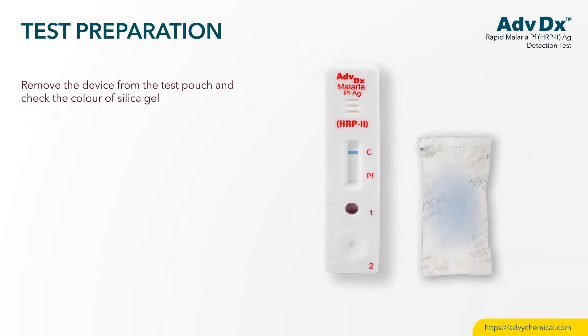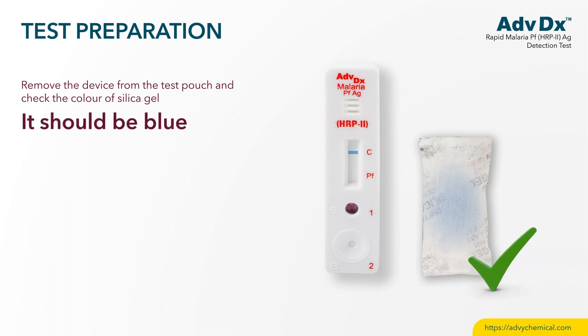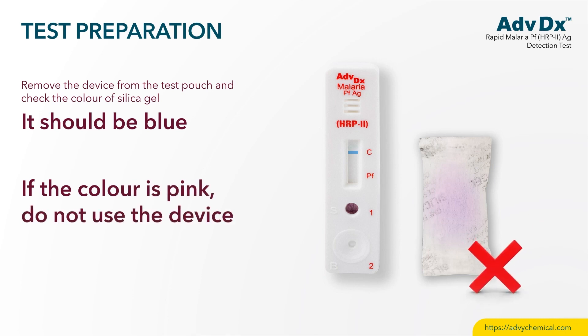Test Preparation. Remove the device from the test pouch and check the color of silica gel. It should be blue. If the color is pink, do not use the device.